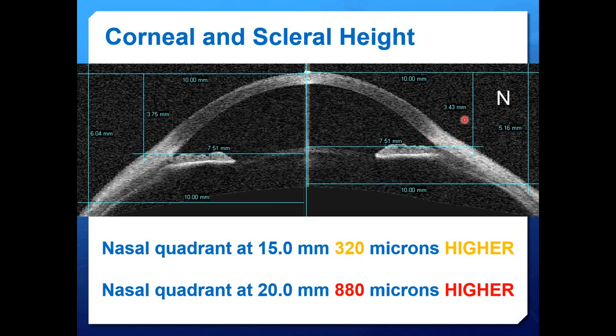In other words, when we drop a contact lens on a patient that lands on the sclera, it should hit first on the nasal side because its elevation is higher. Then there's this greater vault or greater drop on the temporal side, which would cause the lens to fall more temporally.